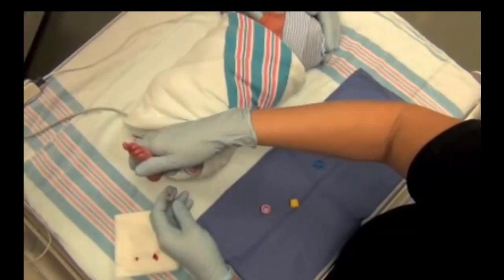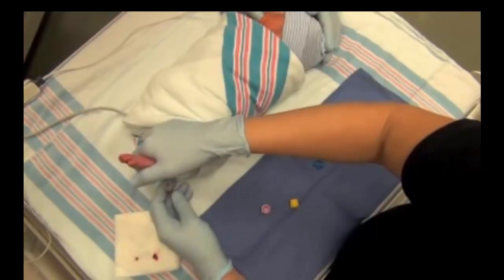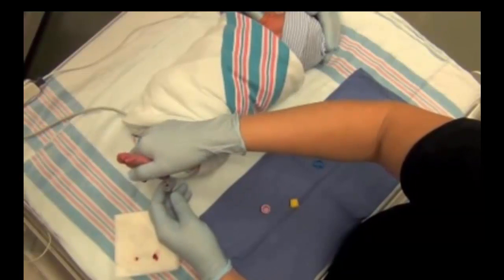Once again, pressure is applied to the calf in a direction towards the heel. Free-flowing blood is collected in the microtainer. When that blood flow ceases, calf pressure is released, the capillaries are allowed to refill, and the process is repeated.